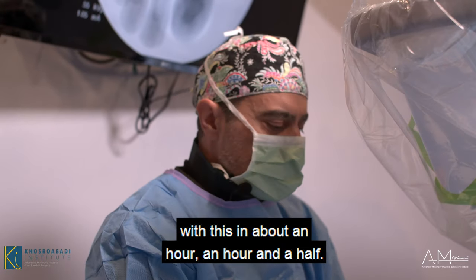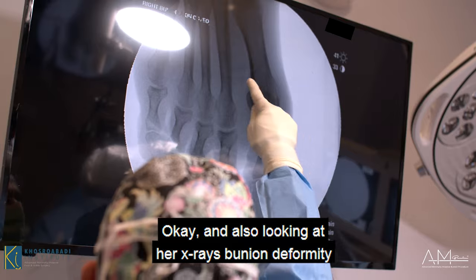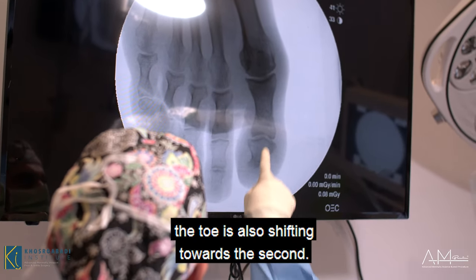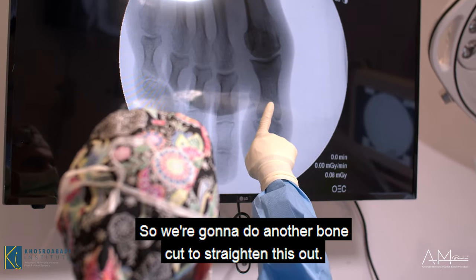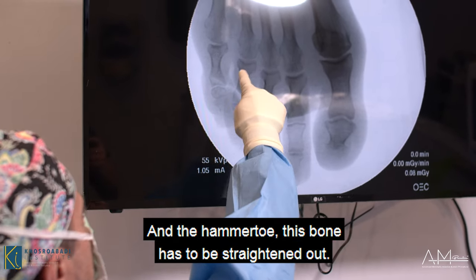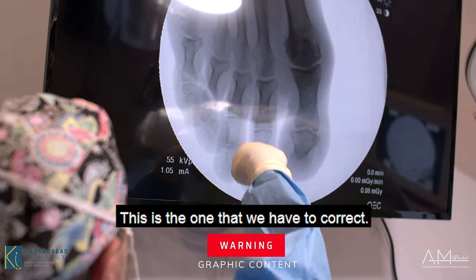I'll be taking you through this — she's going to have a beautiful foot when I'm done, in about an hour to an hour and a half. Looking at her x-rays: bunion deformity right there, and as you can see the toe is also shifting toward the second. So we're going to do another bone cut to straighten this out. The hammer toe bone has to be straightened; these others are fairly straight — this is the one we have to correct.